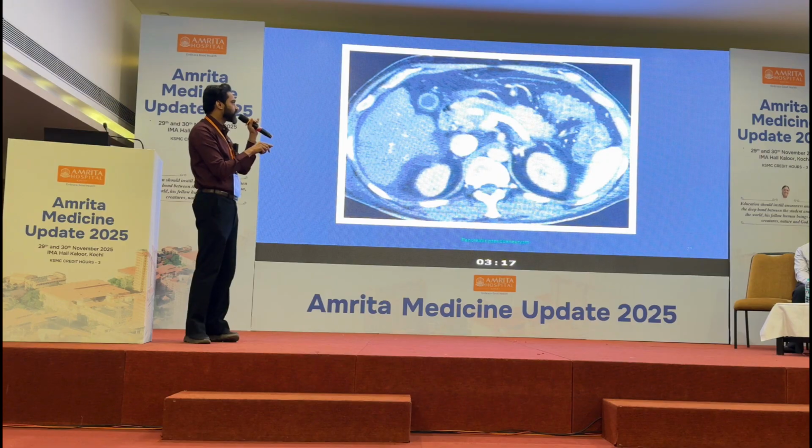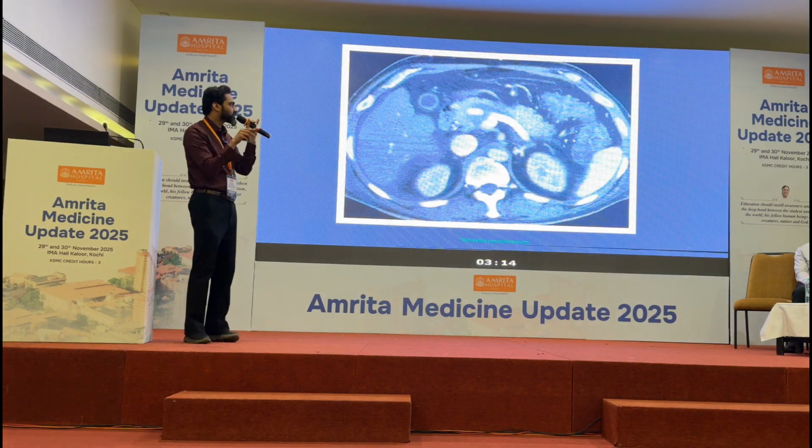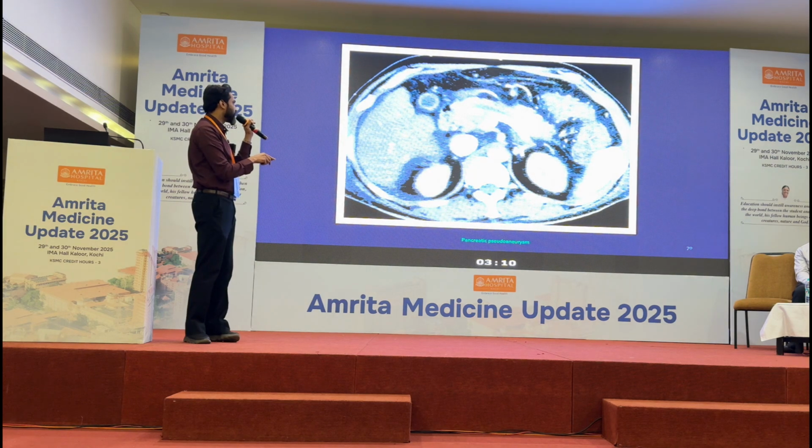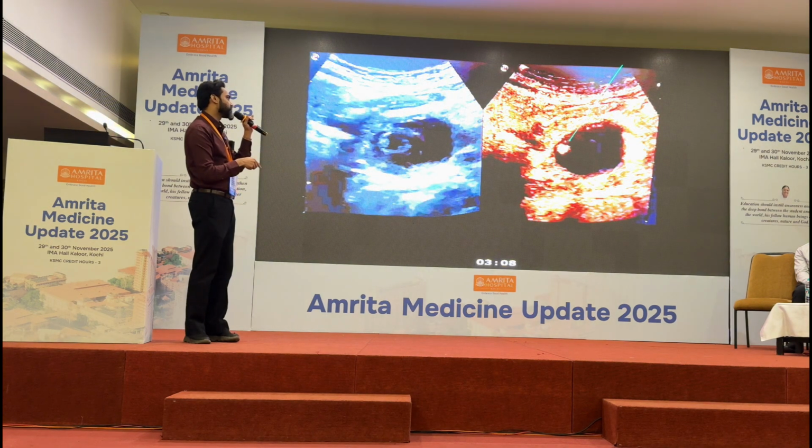So this again, we thought we'll puncture under ultrasound and do the same thing. But under ultrasound also, it was so small that it was not well seen. So then we did something called contrast enhanced ultrasound.